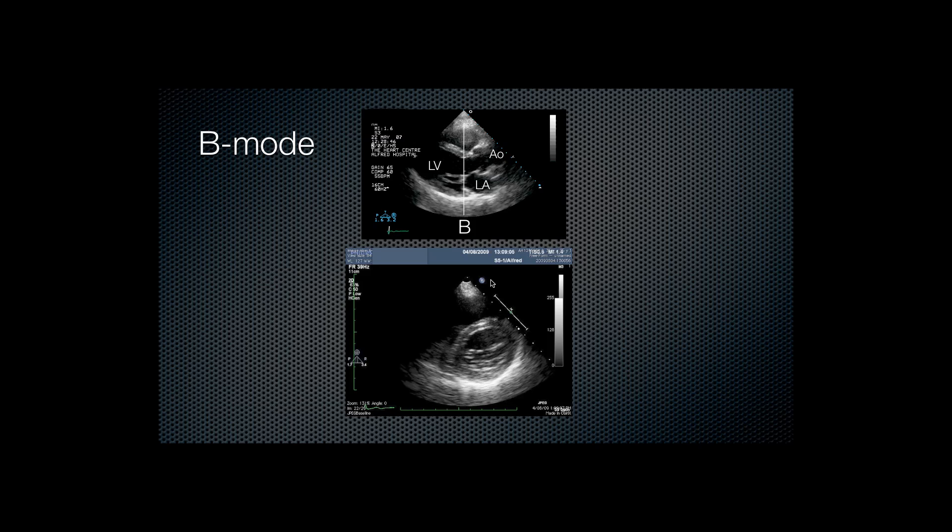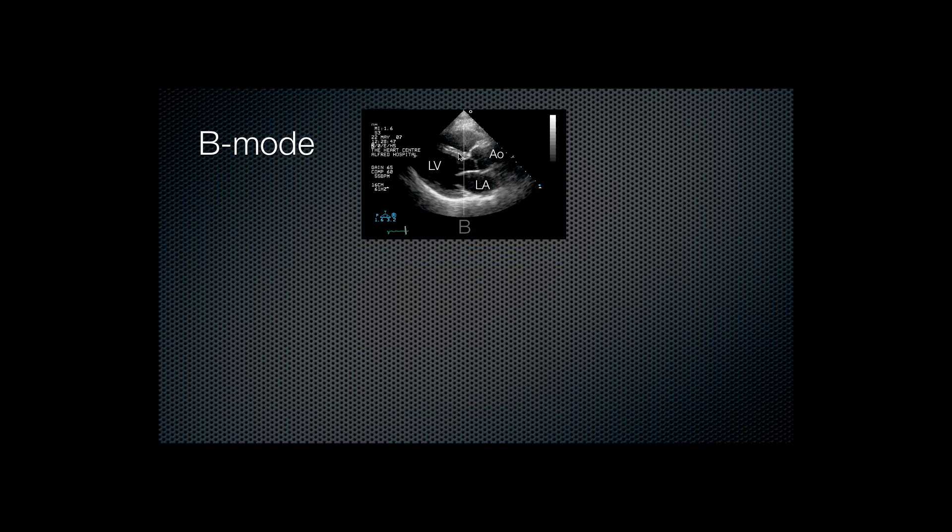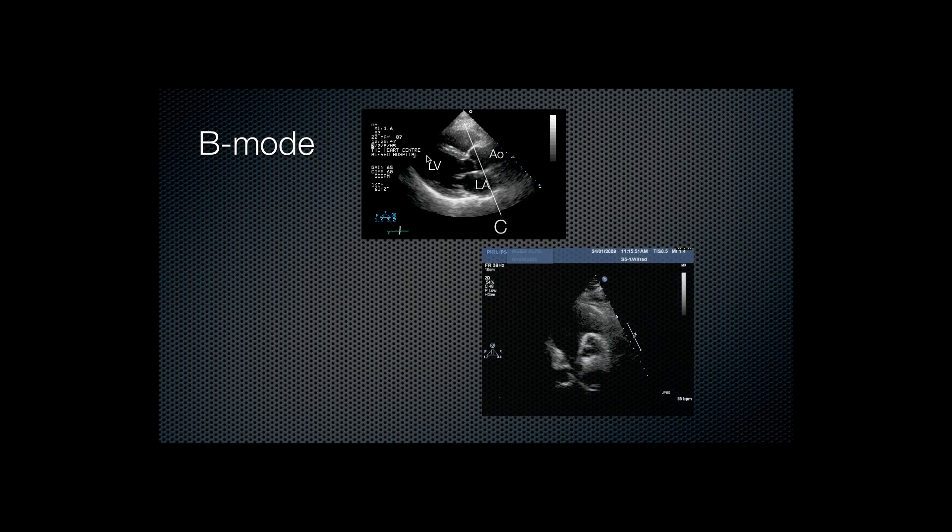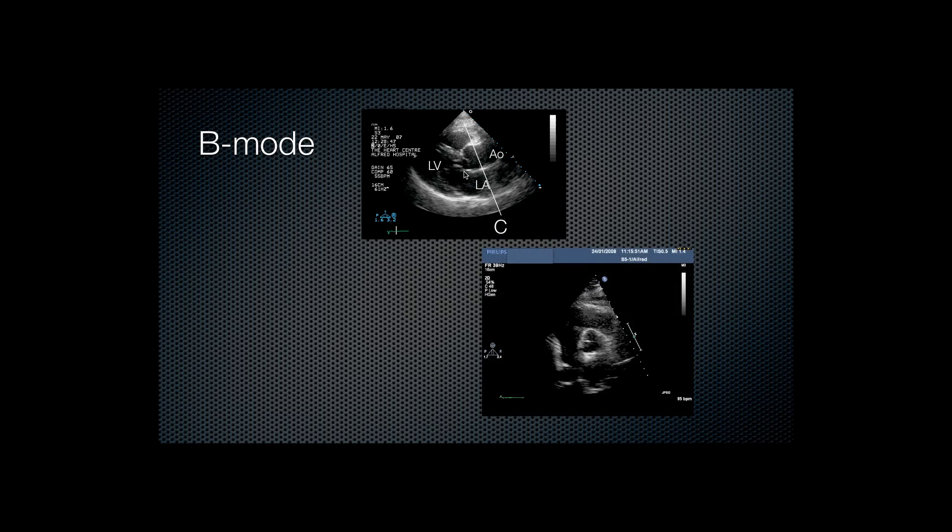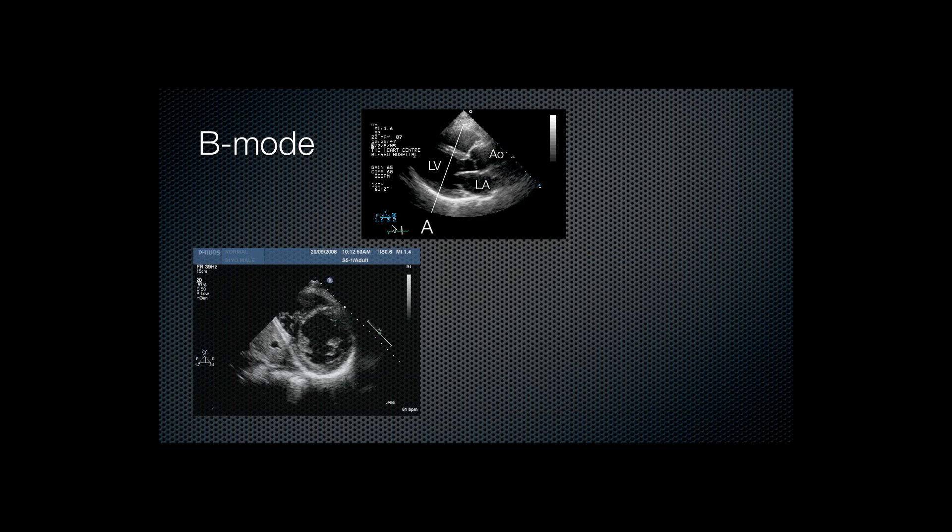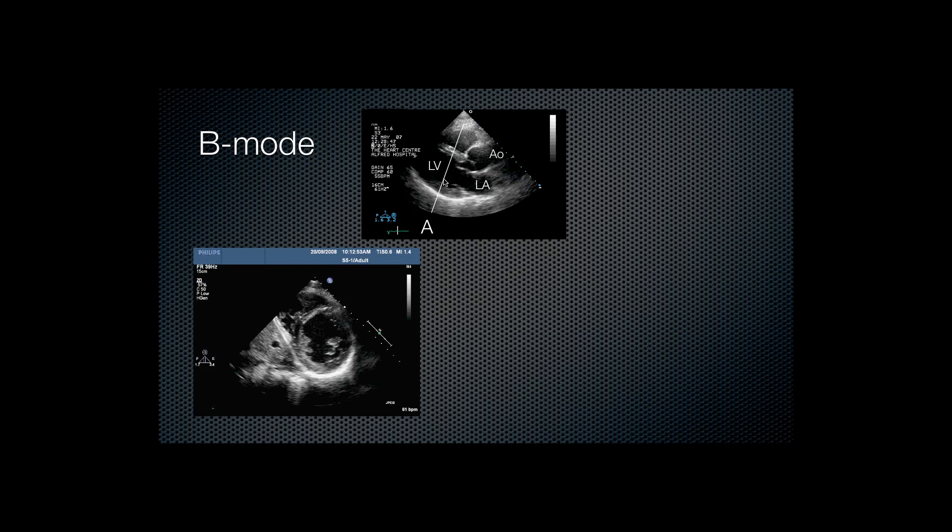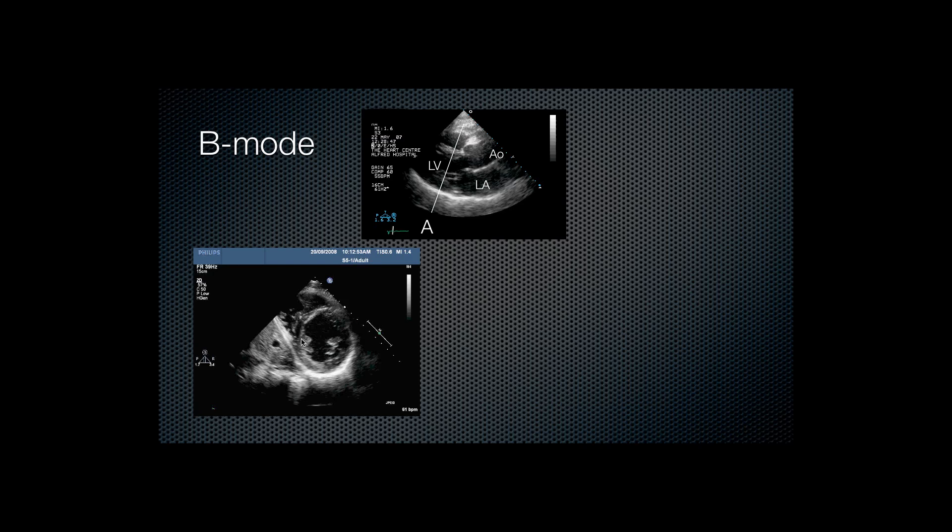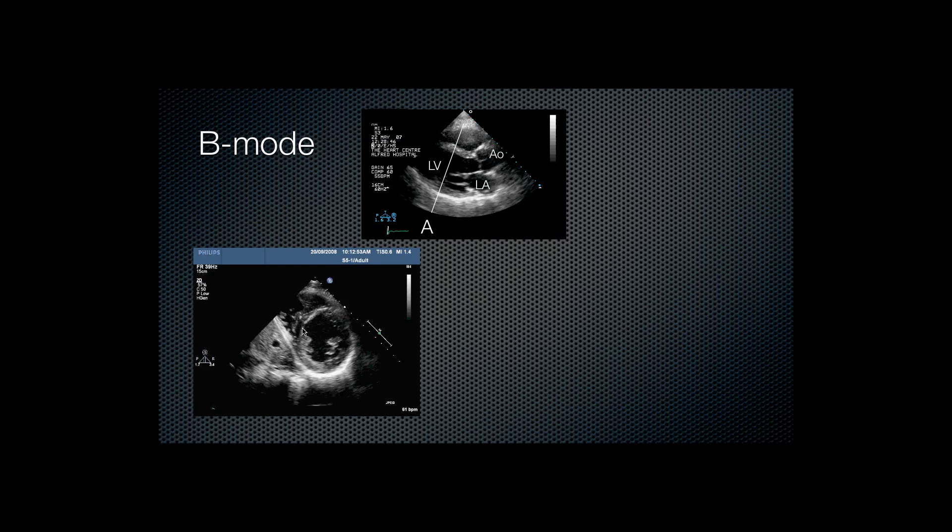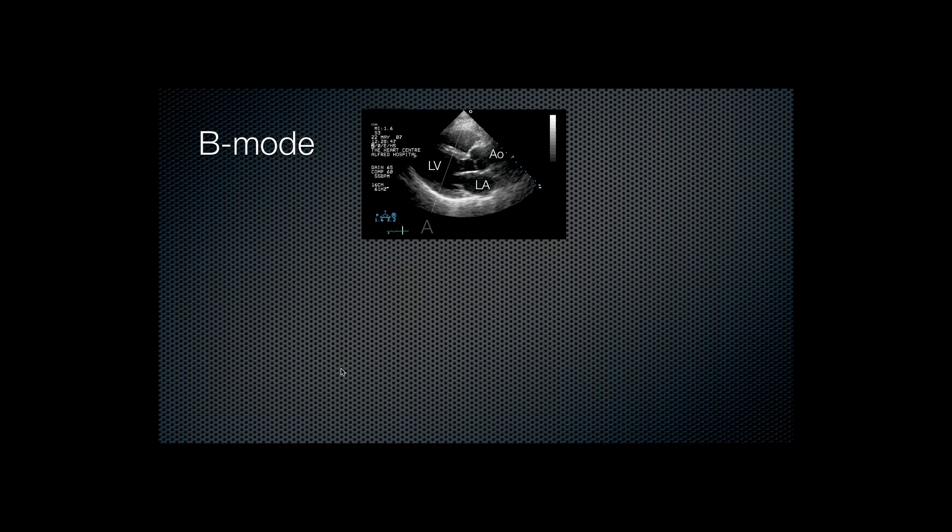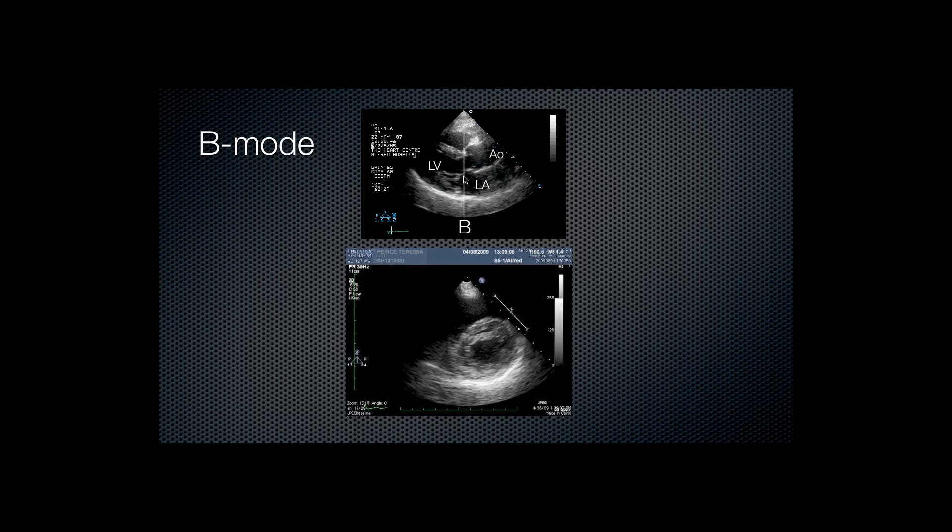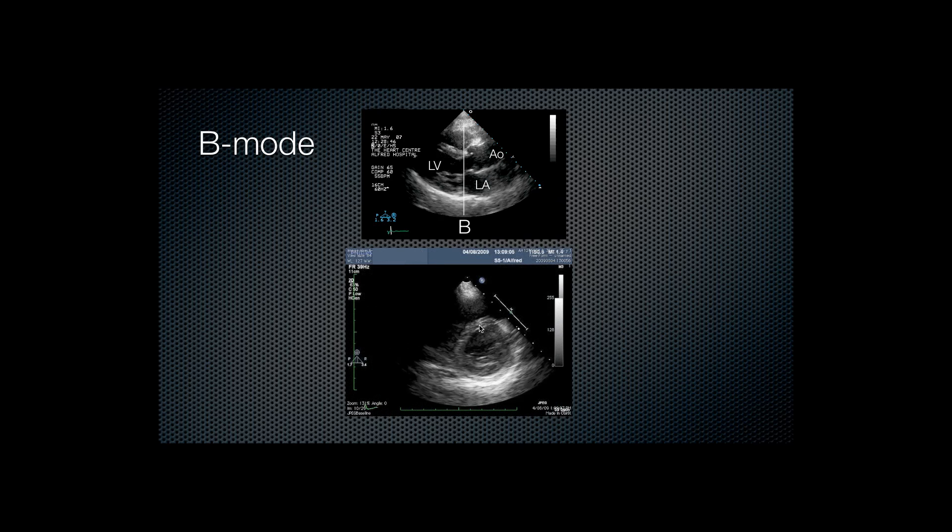And I'll explain in reference to the top image again, the parasternal long axis. Going back to the first one, there's a cut line going through the left ventricle. So we see the left ventricle in cross section.